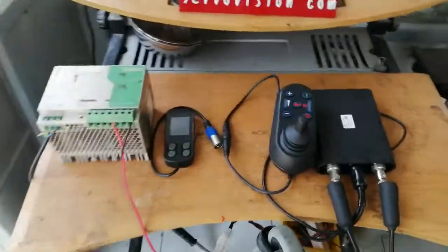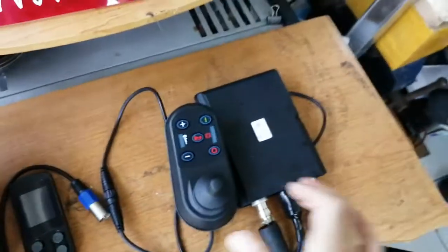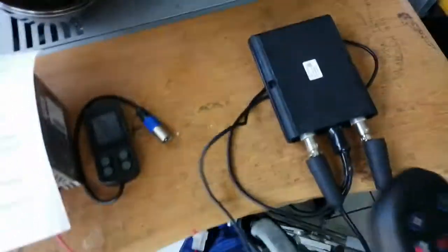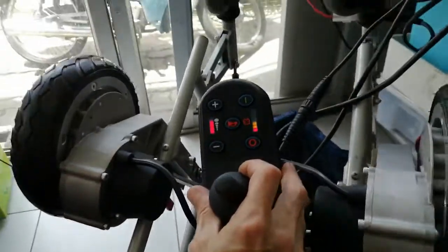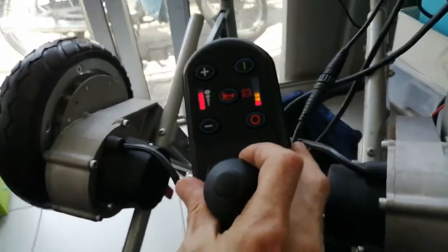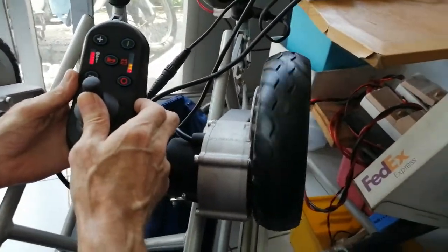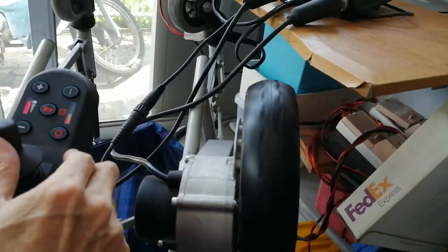So I hope you enjoyed it. I'll make a little demonstration for it. So I switch the system on, and hold it parallel to the wheels so you can see. If I push forward, the moment I'm at the opposite side, you have to imagine it the other way around.